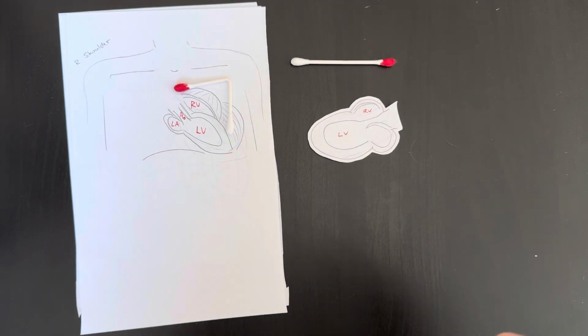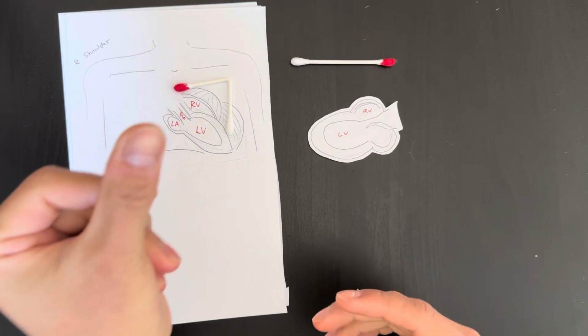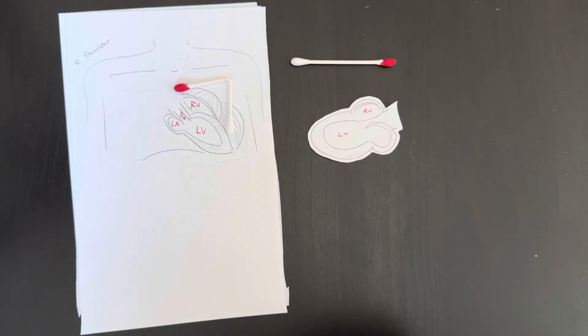Okay, I hope that was somewhat helpful. I think once you get the blueprint down, most of this is just bedside, scan, scan, scan. And after 10, 100 times, this is gonna click and make sense for you. So good luck and happy scanning.